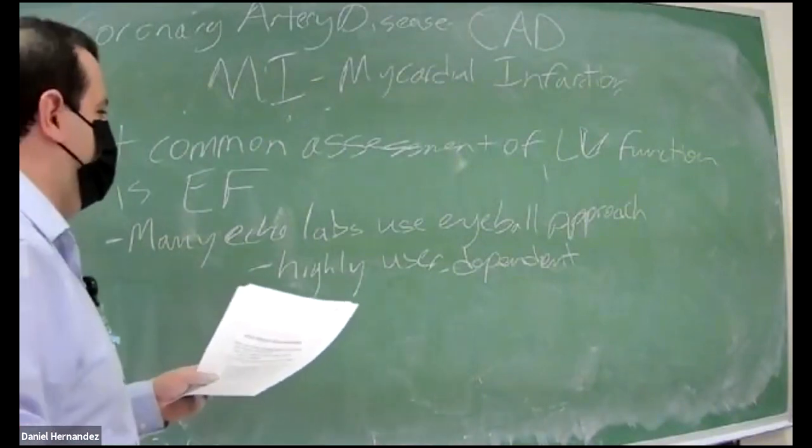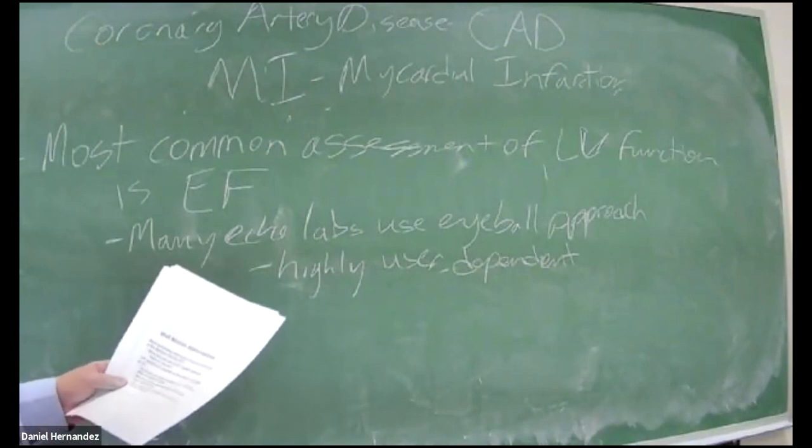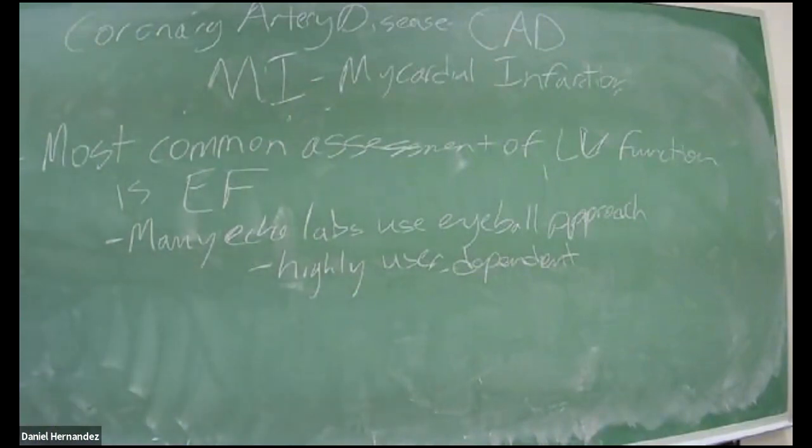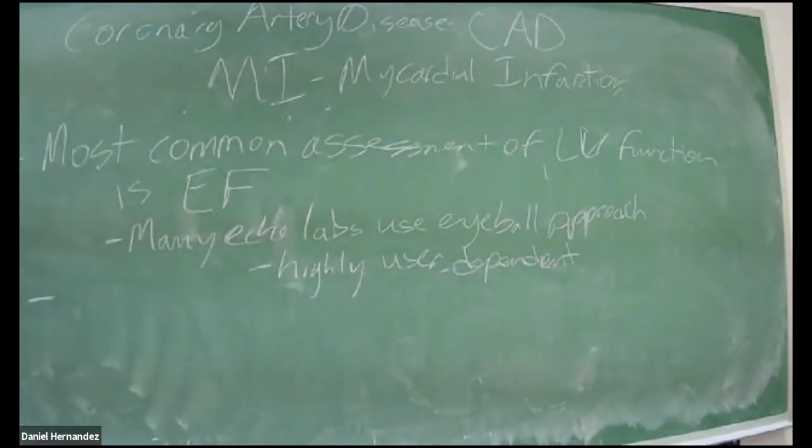Me personally, I think using your eyes to get an idea and then actually measuring LV, measuring EF, is a much better approach. So at least, if you're calculating something that doesn't look like what your eyes are telling you, maybe your measurements are off, or maybe something looks worse than it actually is when you go back and actually do your measurements.